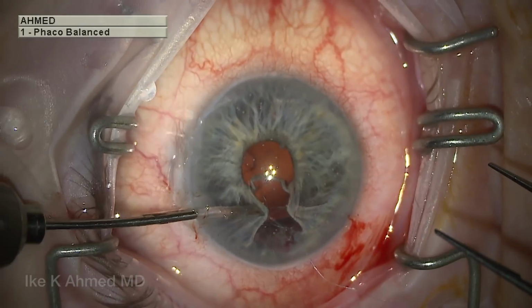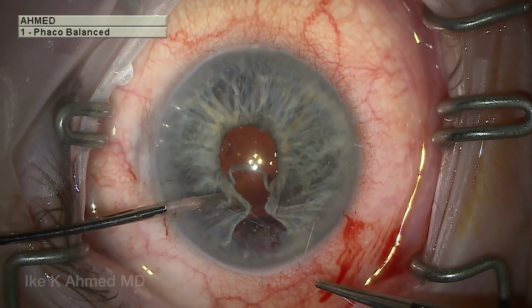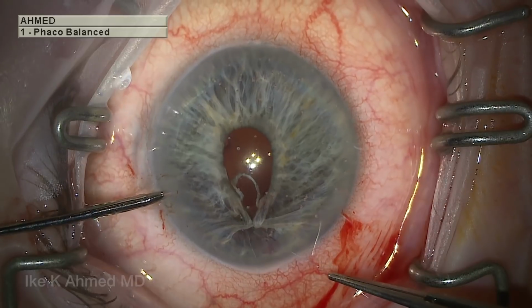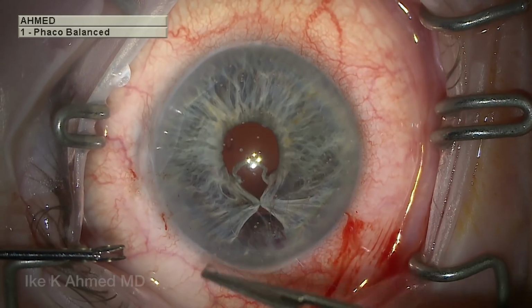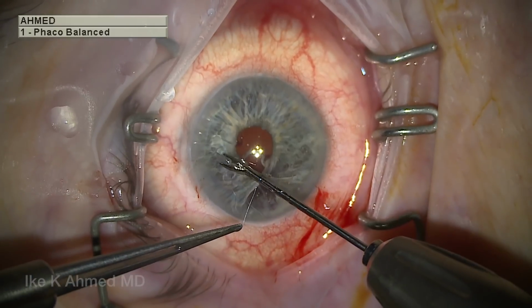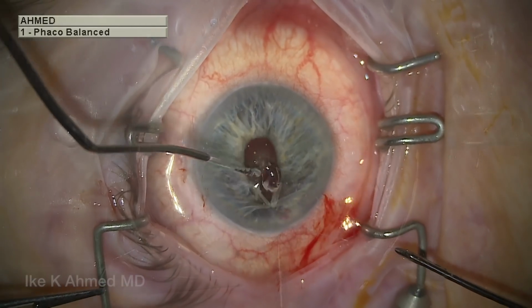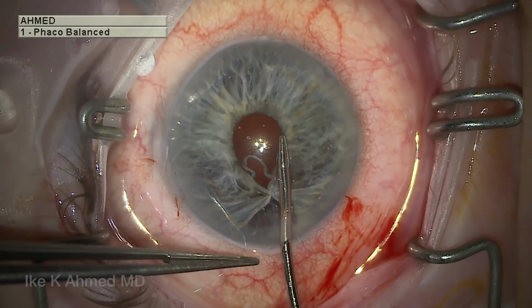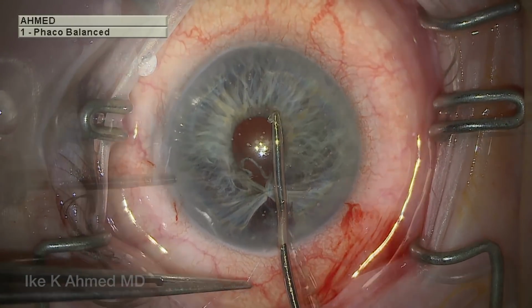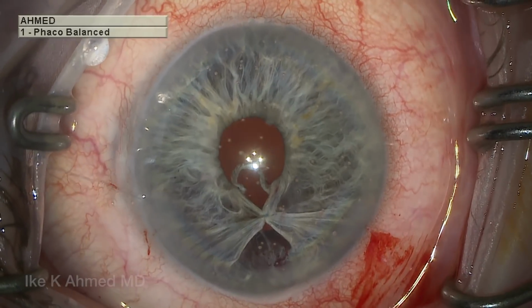The knot is then cinched down, again using a micro tier through additional incisions as needed to bring both leaflets of the iris tear together. We will then lock the suture, again using the long end of the suture to twirl around the micro tier, grabbing the short end and then passing into the eye, locking the knot. A micro scissor is then used to cut the suture ends short.